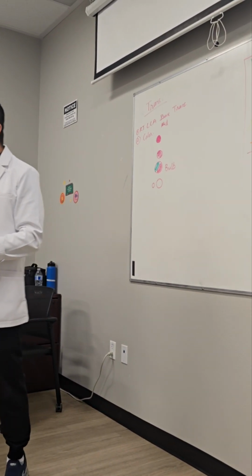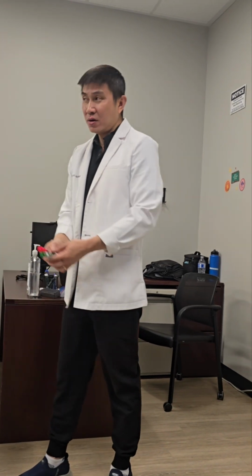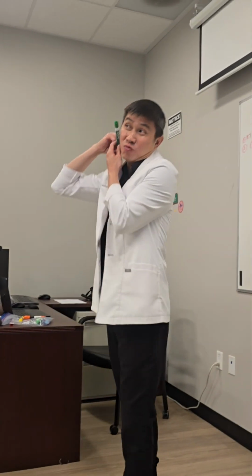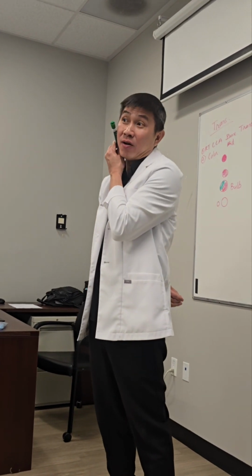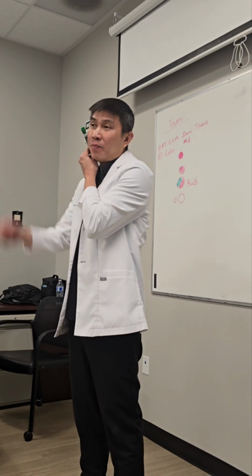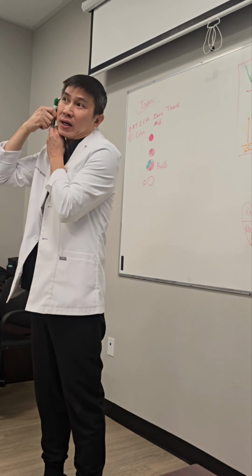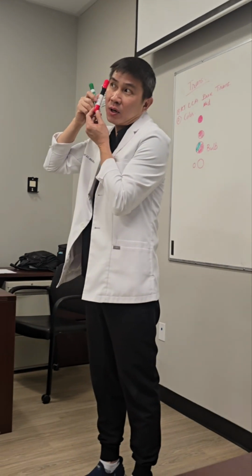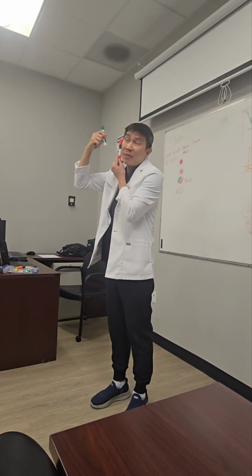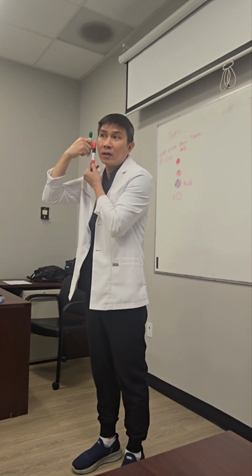the problem is the ICA and ECA positions are very variable. Why do I say variable? Especially in older people, the older population. We learn in the book, this is the ICA and ECA, right? That's what we learn. I just taught you. But some people, they twist and wrap around. Someone may switch completely, and someone may be just front and back. They do not go like the real anatomy we learn.